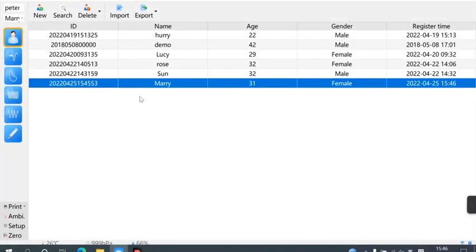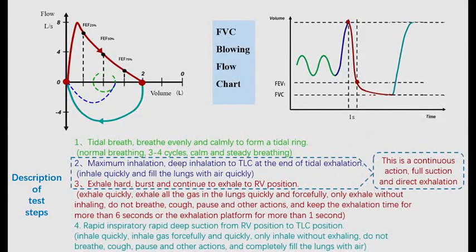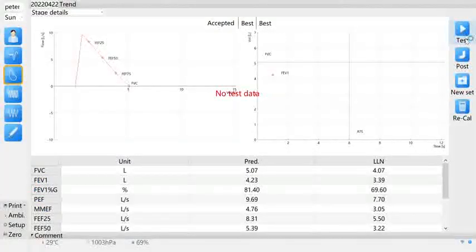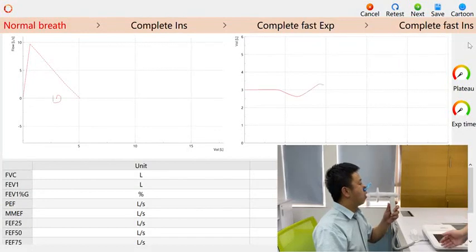Click the third icon on the left to enter the FVC test mode. Before the test, the doctor should confirm whether the tester has relevant contraindications. After confirming the tester's eligibility, inform the tester of the following steps. Click the upper right corner to start the measurement, and the tester starts to breathe normally.